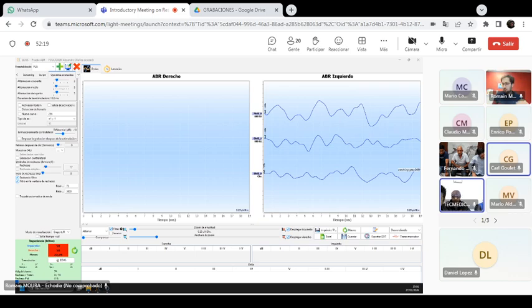Yes. On that point, just have them put it down in writing. They have no reason to observe that. They're asking for two electrode kits. Really, for each test you only need 4 electrodes, correct? Yeah. So we have 20 electrodes for the cable. So we're delivering 5 electrode kits. So they should just not say anything.